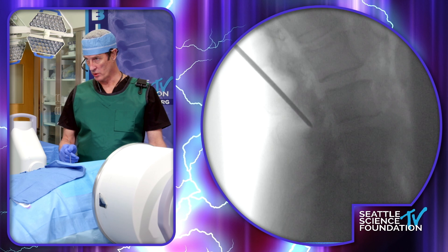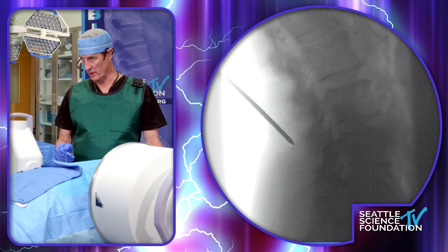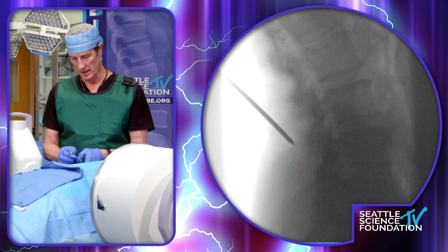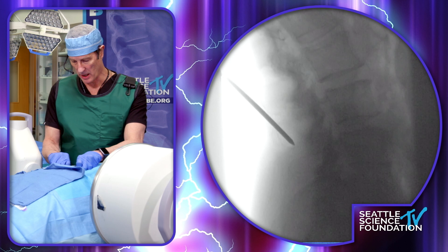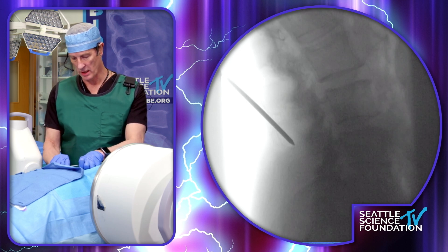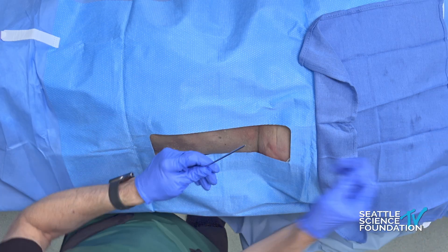I'm going to go down just a smidge from there. This is going to be our starting point. We're going to go through the interspinous space right there, just posterior to the inferior articular process. I'm going to make an incision there — it's about a two-centimeter incision roughly, same as some of the other lateral approaches.